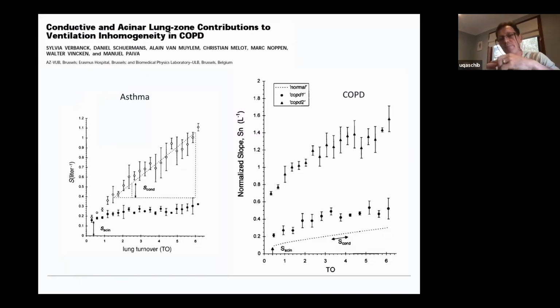And so you can see we can use this technology to separate convection dependent and diffusion dependent processes in one test. And it can be done during mechanical ventilation because we can fill the lung with a tracer gas, switch the tracer gas off, and measure the exhaled concentration.